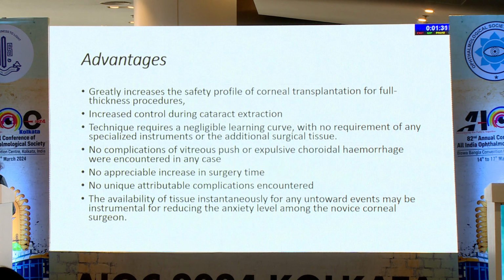The advantage of this novel technique is that it greatly increases the safety profile of full thickness corneal transplantation. There is increased control during cataract extraction. The technique requires a negligible learning curve for novice surgeons. No complications of vitreous push or expulsive choroidal hemorrhage were encountered, and there is no appreciable increase in surgery time, and no extra funds or expenditure involved in this procedure.